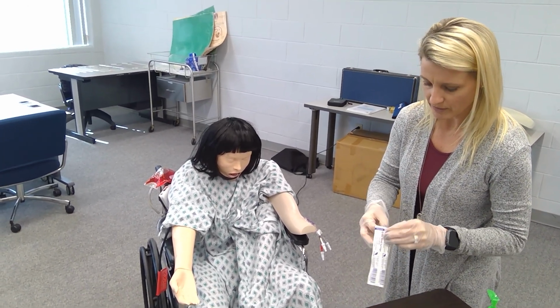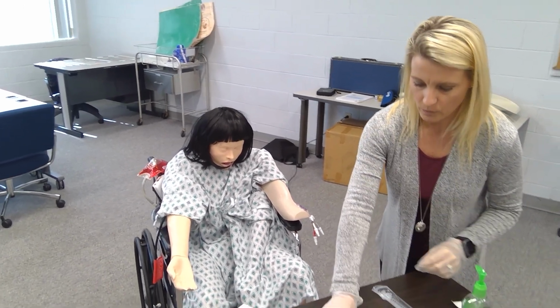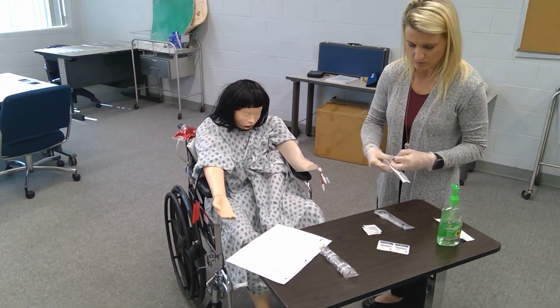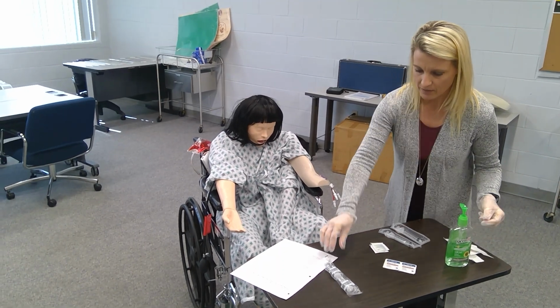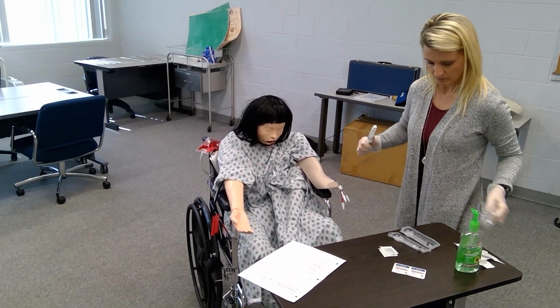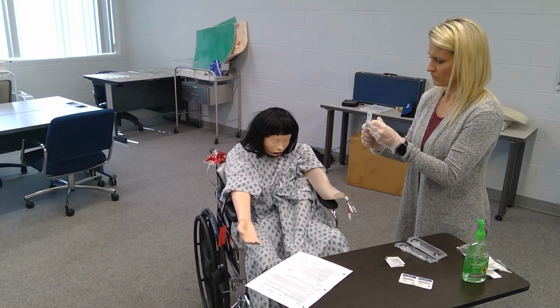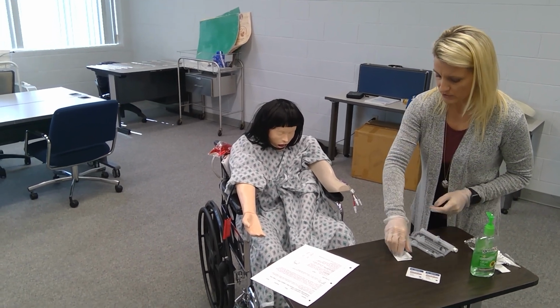For this procedure, I'm going to need 2 10 ml syringes. One of them is going to be for my waste, and one of them is going to be for my blood sample that I'm going to send to the lab. And then I'm going to have to flush out the line. Have they drawn blood from your PICC line before, Sarah?